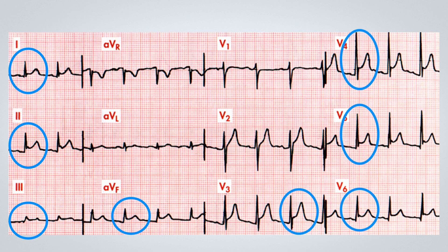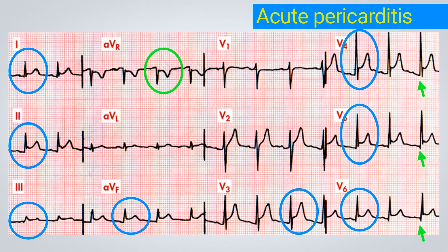Additionally, we can observe a depression of the ST segment in aVR, associated with an elevation of the PR segment in aVR and a depression of the PR segment, particularly in the lateral wall from V4 to V6. This case is highly consistent with an acute pericarditis presentation, as there is elevation of the ST segment in almost all the walls, except for aVR, where we have a depression.